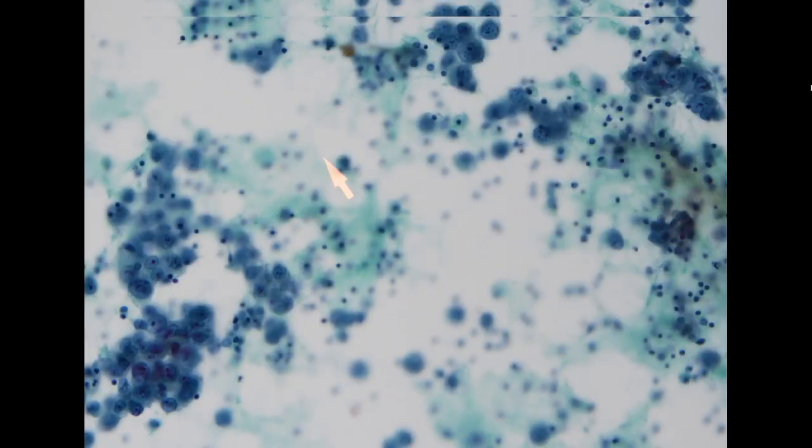Let's move to a pleural effusion specimen. This is from a 69-year-old female. Just on low power, you can already appreciate that there are a lot of big cells with dark nuclei, and a lot of them are arranged in a tight, three-dimensional architecture. So on low power, this looks like a positive specimen. So we just need to go to higher power to confirm the cytomorphology.